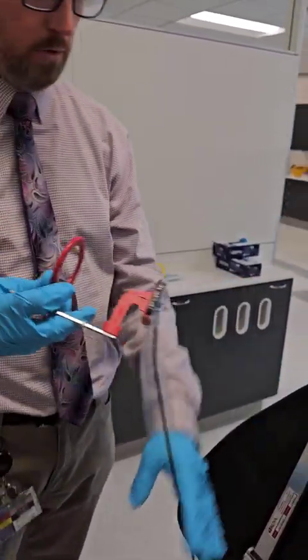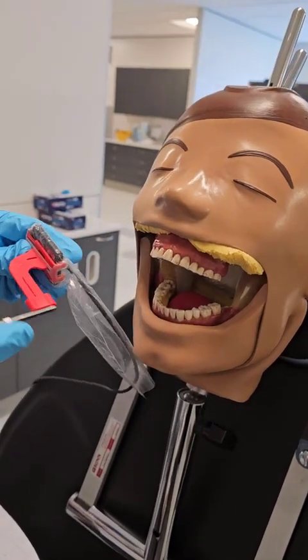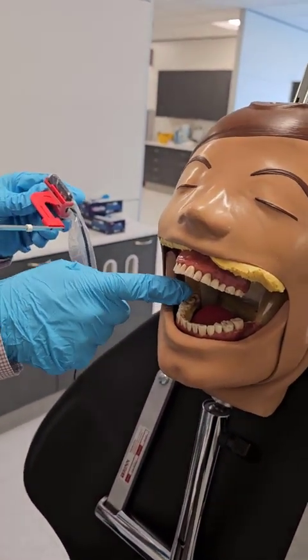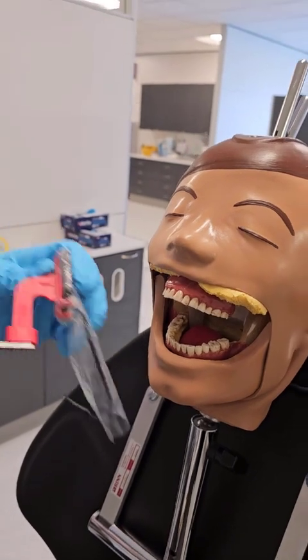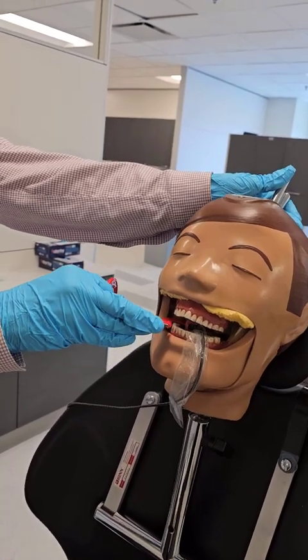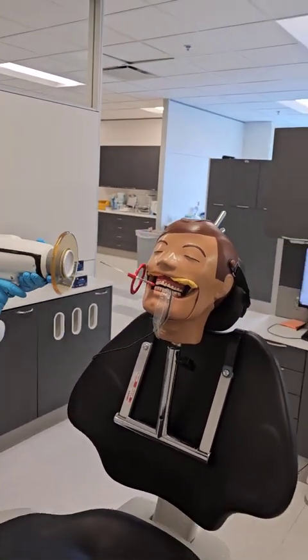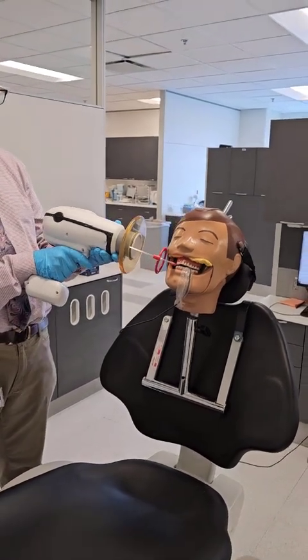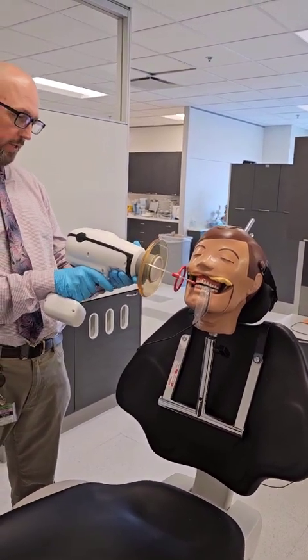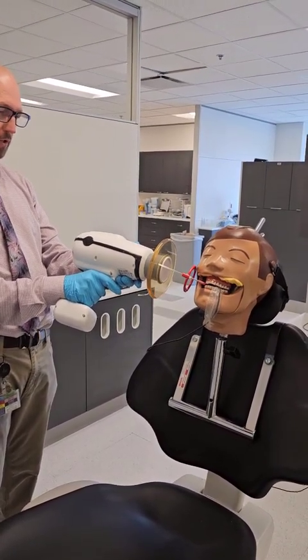I'm going to start with the molar. Just like with the periapicals, I want it to center on the distal of that first molar. That little notch is going to be roughly the center of your sensor, so you want that notch lined up as much as you can distal to the first molar. Patients can't tolerate too far back there, so usually it's going to be just about at that contact, maybe a little bit on that second molar if you can. I'm going to try parallel, although it is coming up a little bit — maybe I'll flatten that angulation just a little bit. I want to pay attention to where that sensor is and try to get just the right angulation of all those contacts.